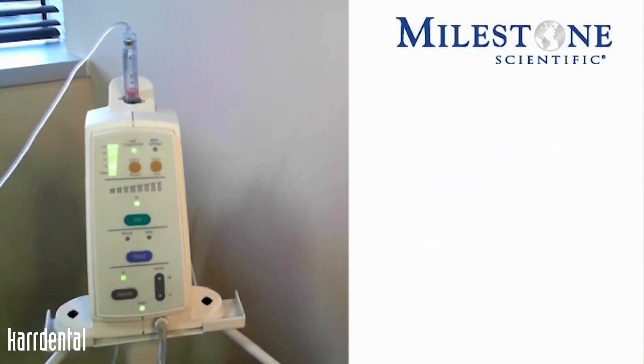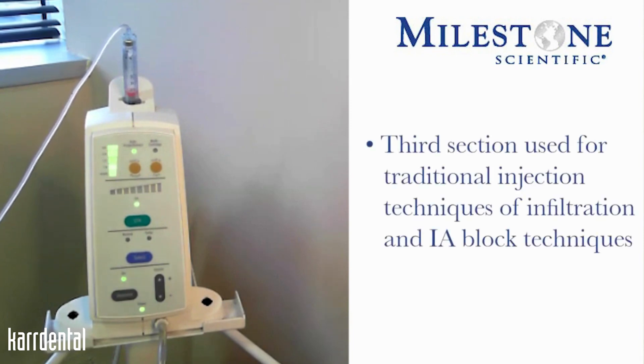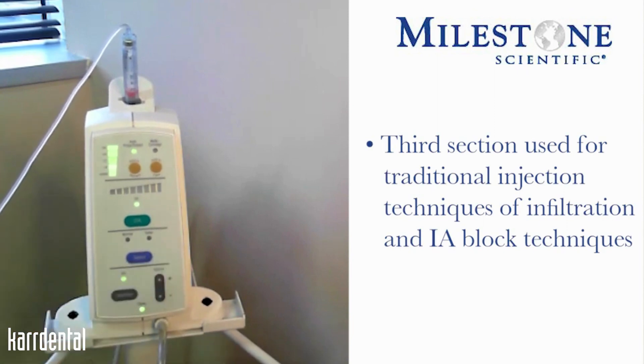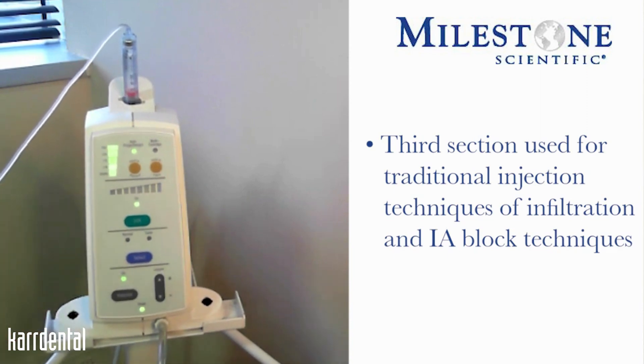The third section you'll use when you're doing your traditional injection techniques of infiltration and your IA block injection. You will see Normal and you will see Turbo. Normal will have two flow rates: a controlled flow followed by a rapid flow. So when we are doing our infiltration or our block injection, we will first start in the Normal mode.